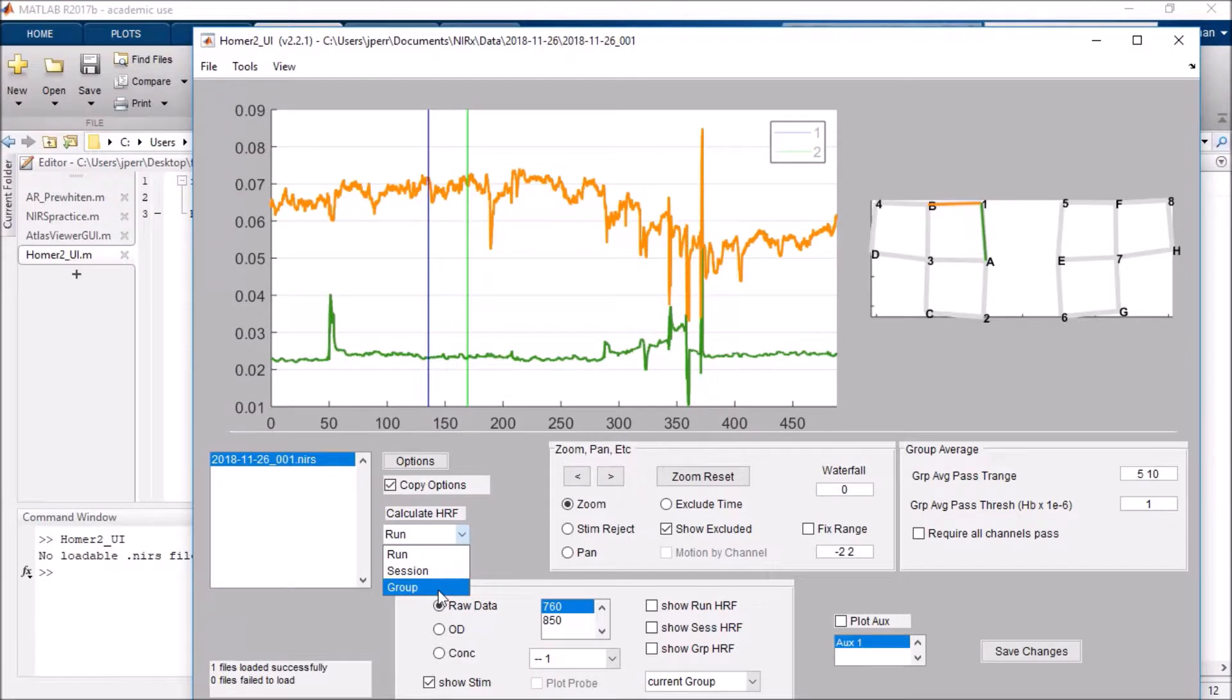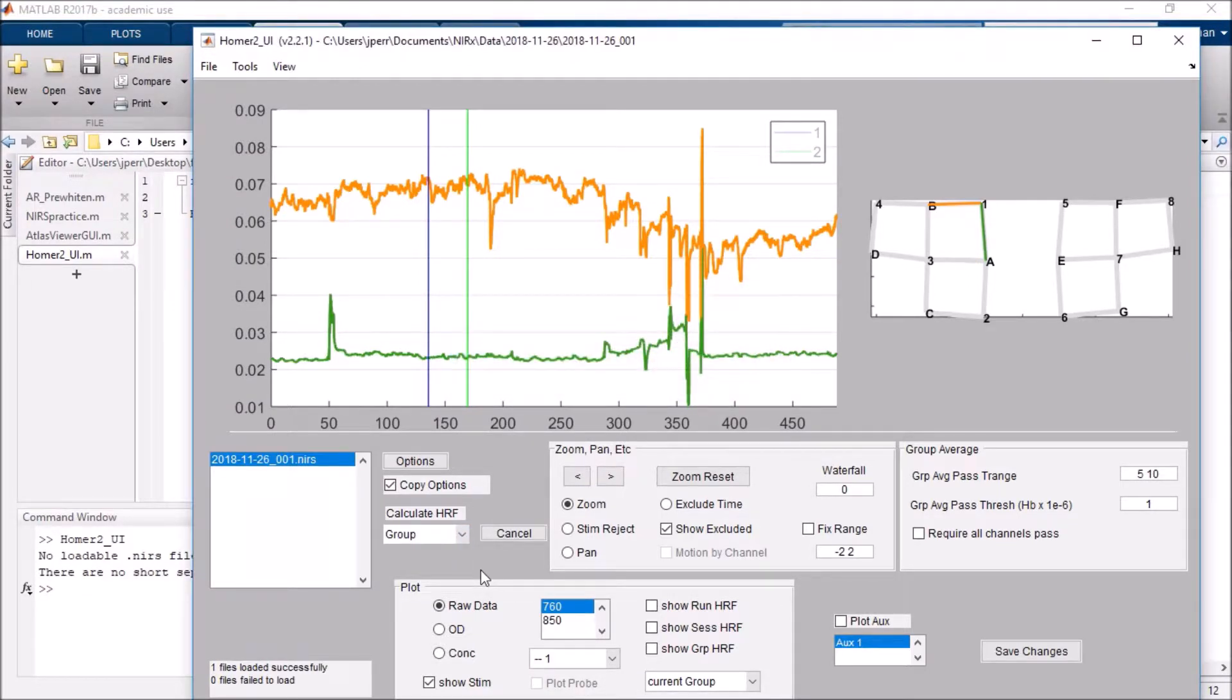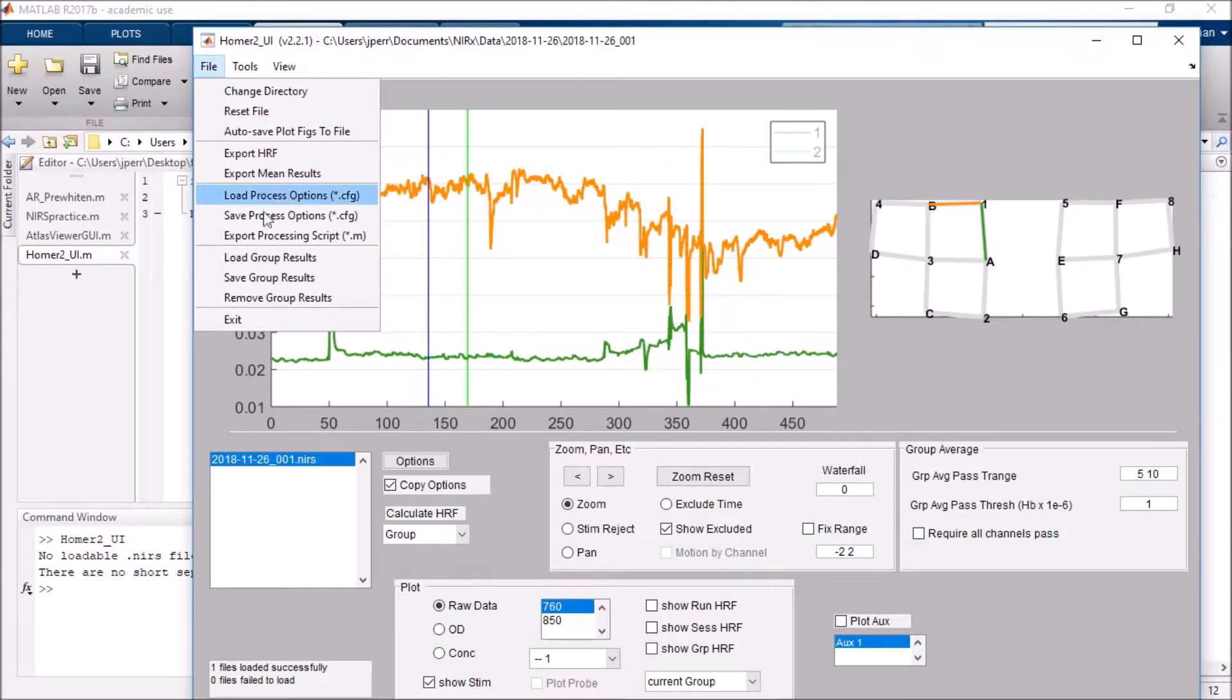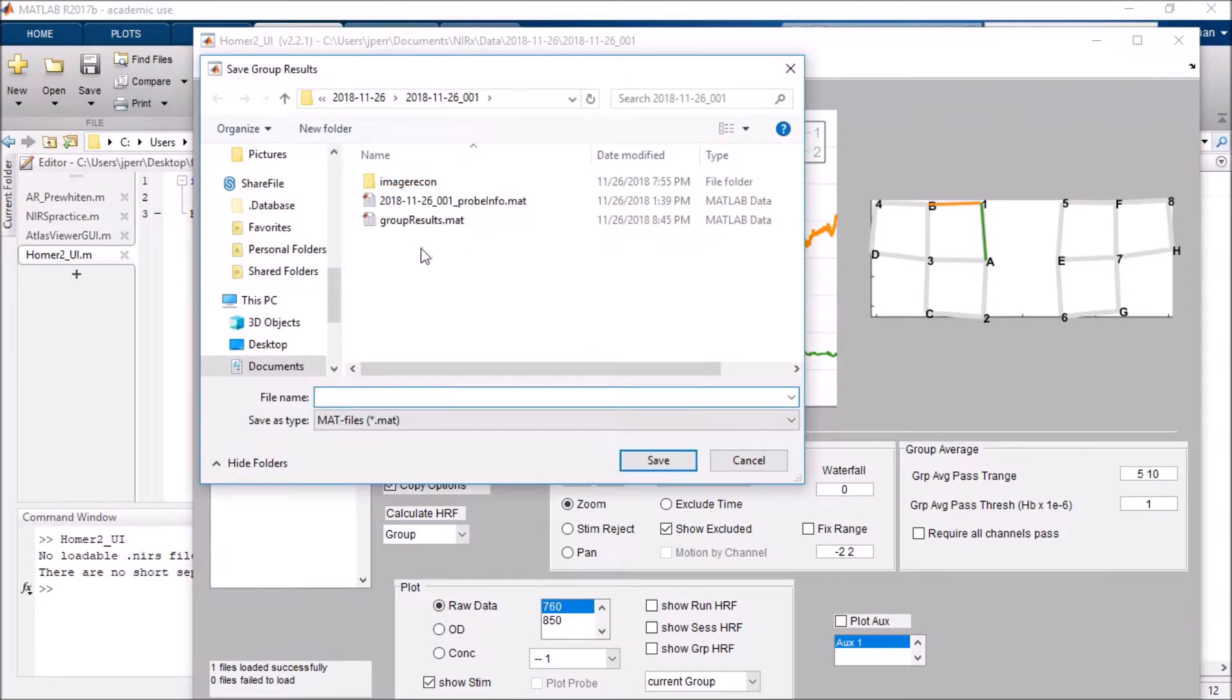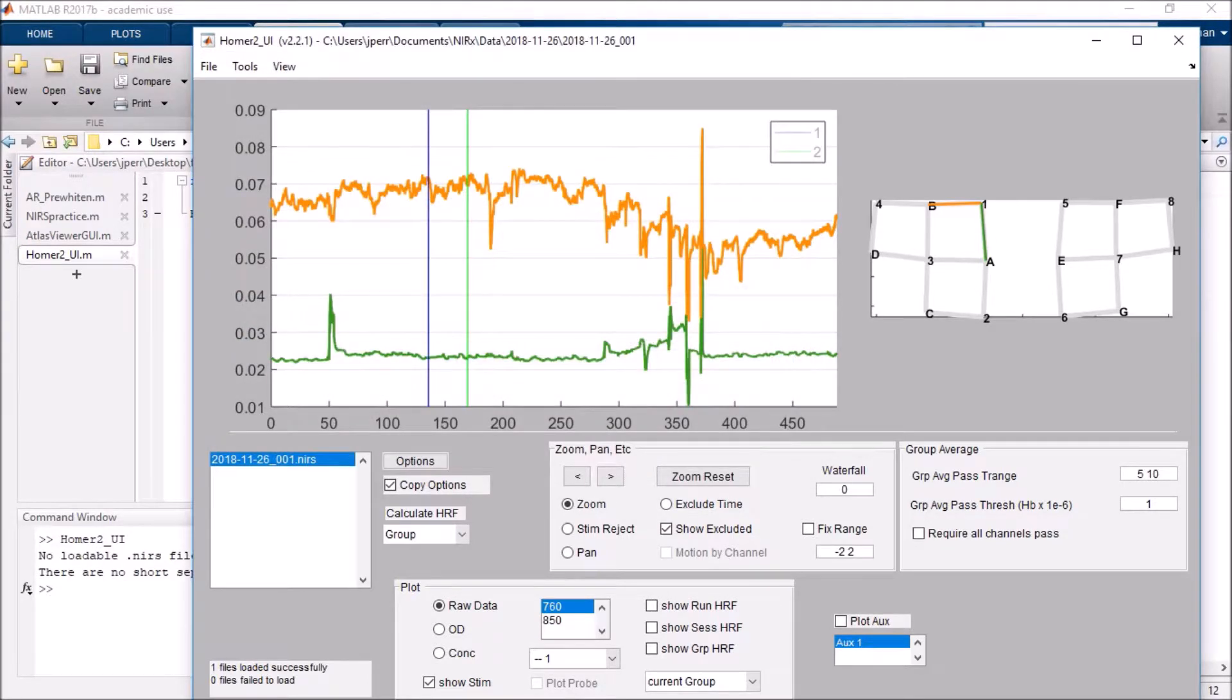You will need to run it to the group level. Running it to the group level will actually output a groupresults.mat. And if I go to save group results, you'll see I already have it saved, but I'll go ahead and replace it.